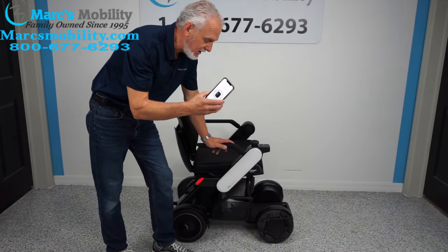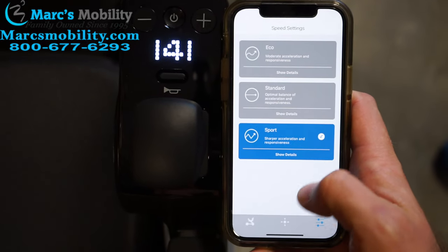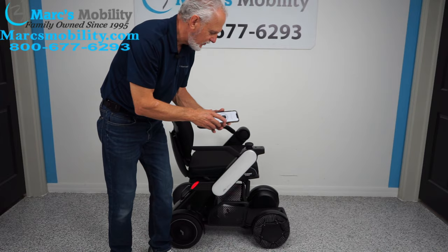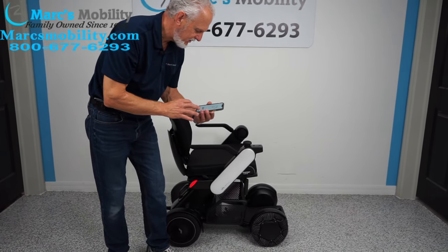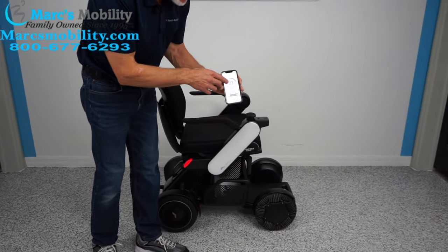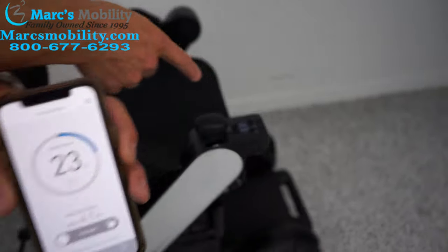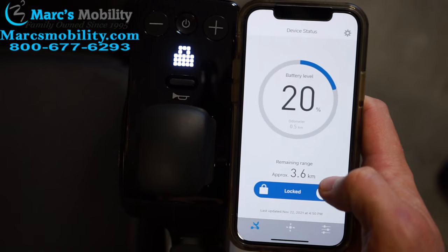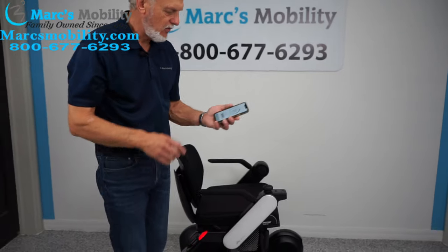There's also programming in the app — you can soften the speed and tone down the response, all from your app. The app also tells you how much battery you have left: it says 23 here, matching the 23 on the joystick. You can also lock this chair from the app — if you don't want someone to mess with your chair, just hit the lock button.